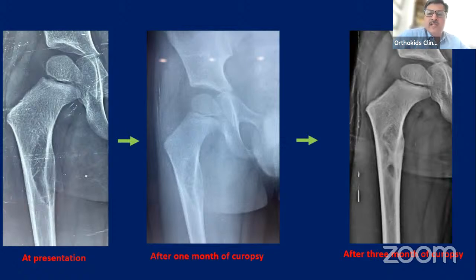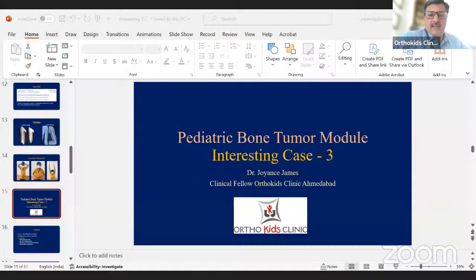Let's move very quickly through the next two cases, Joyance. We are having only 6 minutes, so 3 minutes for each case. I would like you to just rush through.